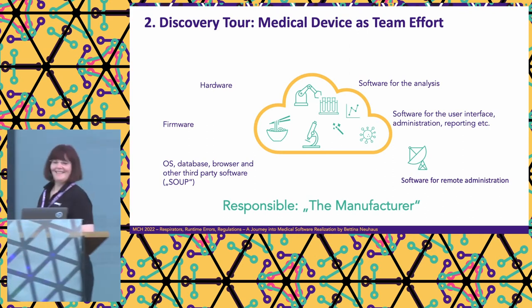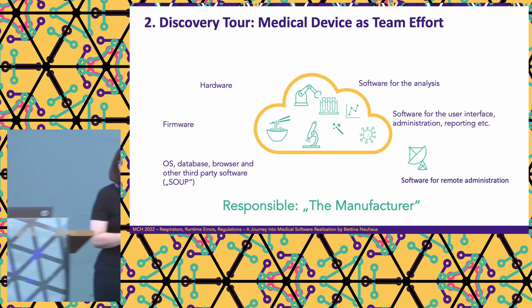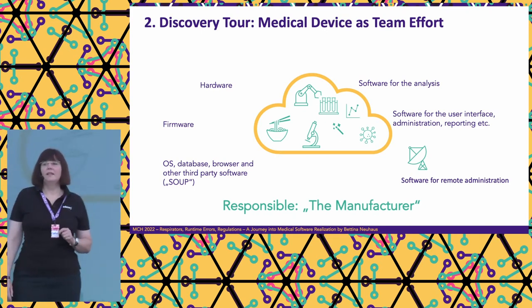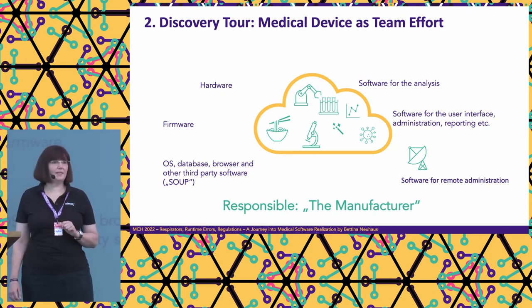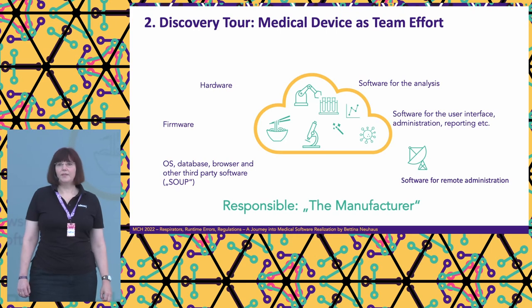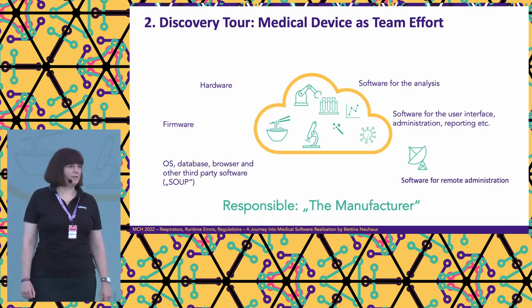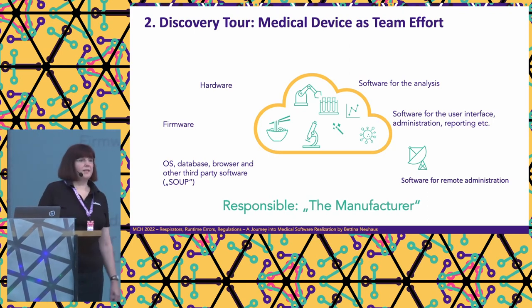So that's important. And also, on the lower left, you see the third-party applications. Of course, you will not write everything from scratch. You will not most likely write an operating system. Sometimes you do, but often you don't. And you take third-party software. That is called here a SOUP, a software of unknown provenance, which means you haven't written the code yourself, but you still have to make sure that it is safe for your medical product. So you have to take the measures. Sometimes this supplier of, for example, the operating system is also certified for medical products, but often is not. And then you have to take measures to show that it is still safe. So you have to consider time and effort for this as well.